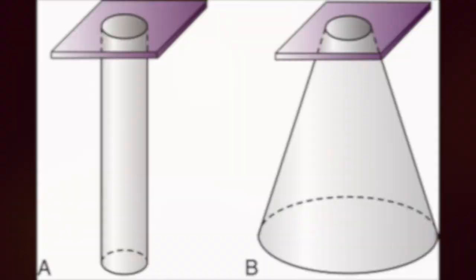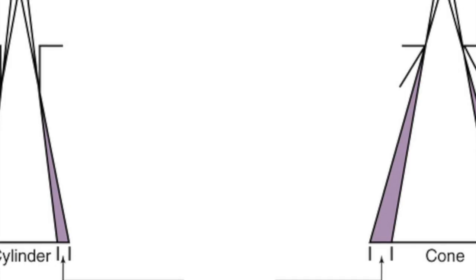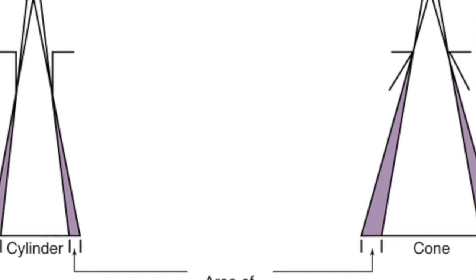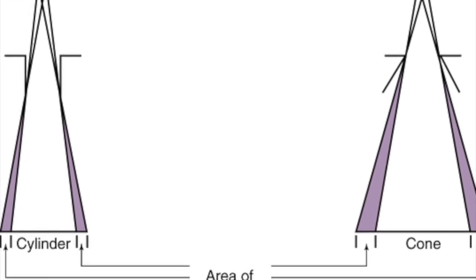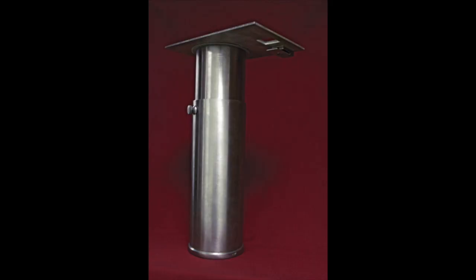Cones have a disadvantage compared to cylinders. If the angle of the flange of a cone is greater than the angle of divergence of the primary beam, the aperture diaphragm of the cone is the only metal restricting the primary beam. Therefore, cylinders are more useful than cones.